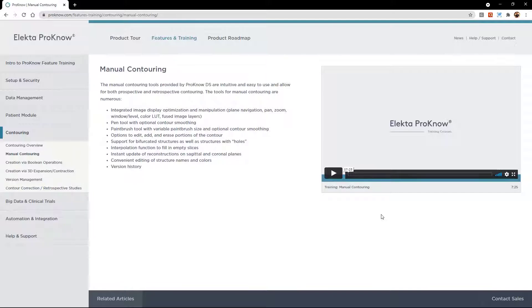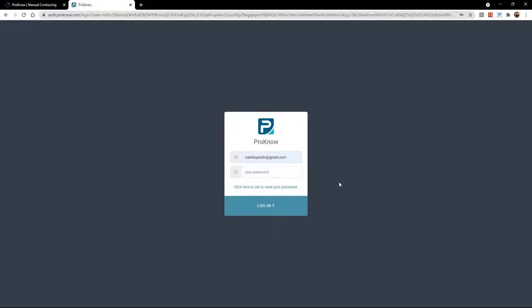I'll go ahead and show you specifically how you will get going in the C3RO program, so it won't be a ProKnow training per se. It'll just be how to log in the first time, how to create your password, et cetera, and then how to go in and start creating contours. So we'll get to that right now. First, what you're going to do is type C3RO.proknow.com. That's going to be the specific domain used for this. Then what you're going to do the very first time is you need to create your password.